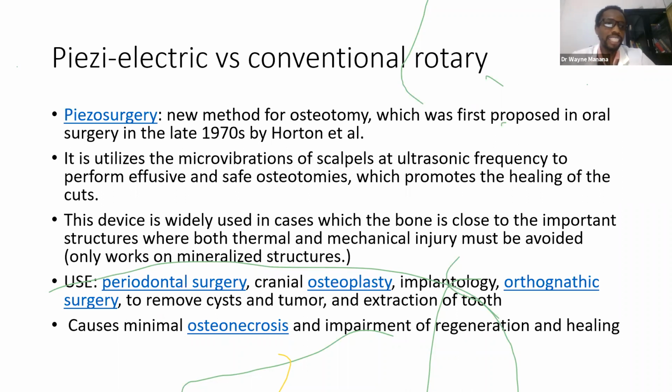The drive nowadays is to use piezoelectric. It's a new method of cutting bone, although it was first proposed in the 70s by Horton, and it basically utilizes micro vibrations of scalpels, like ultrasonic. The device is widely used in cases in which bone is close to vital structures, like nerves and soft tissues. And the good thing is piezo tends to avoid the risk of thermal and mechanical injury.